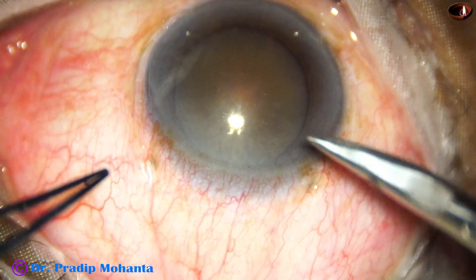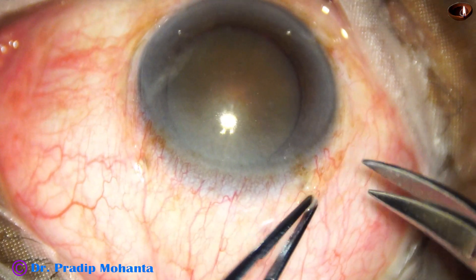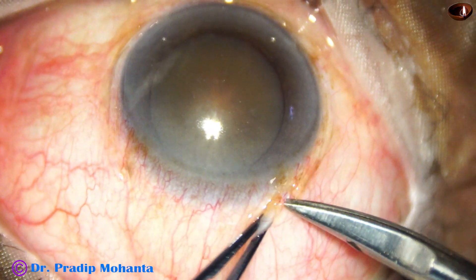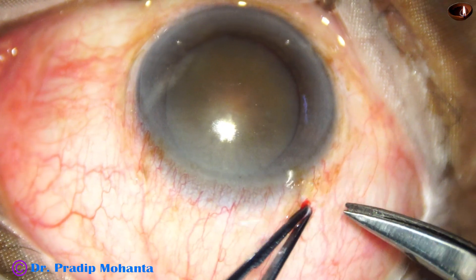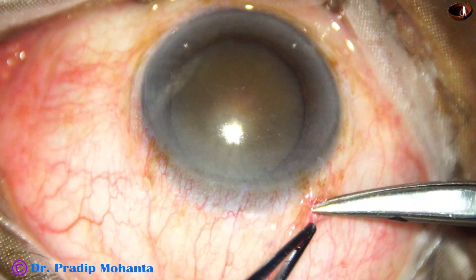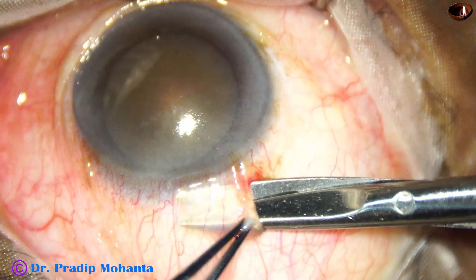And this is peritomy. Peritomy is being done for about 2 and a half clock hours so that we expose an area of about 8 millimeters.